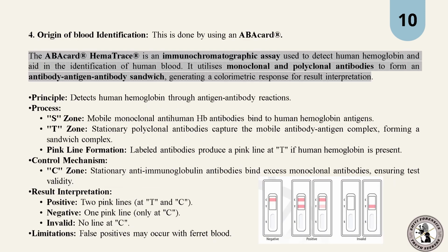Now we will perform the test for determining the origin of the biological fluid. So in this, for blood, we will perform the ABA card. Now the ABA card is an immunochromatographic assay. So why is it immuno and chromatographic? We use the chromatographic technique principle in it, and with the help of antigen antibody reaction. So that's why this is an immunochromatographic assay.